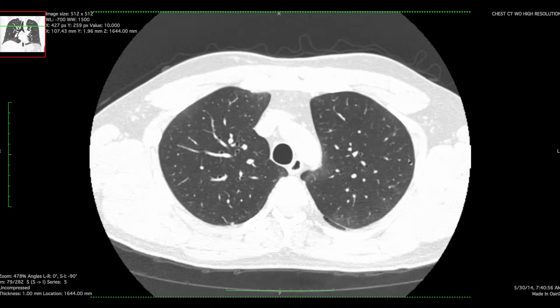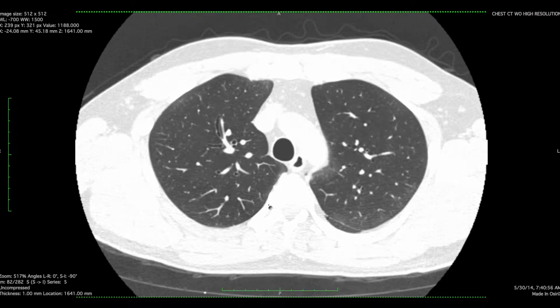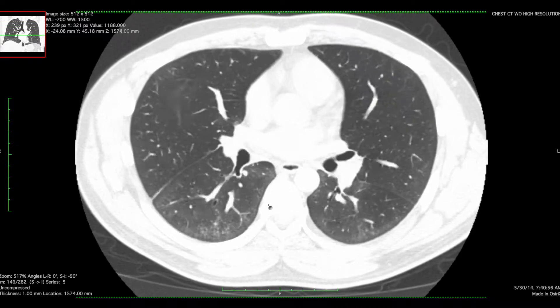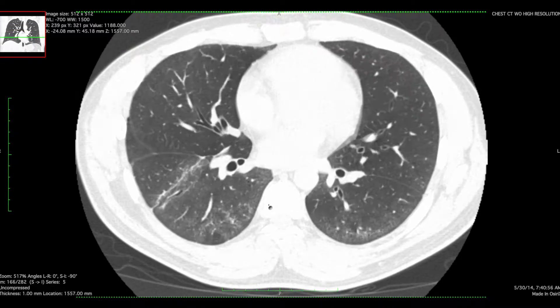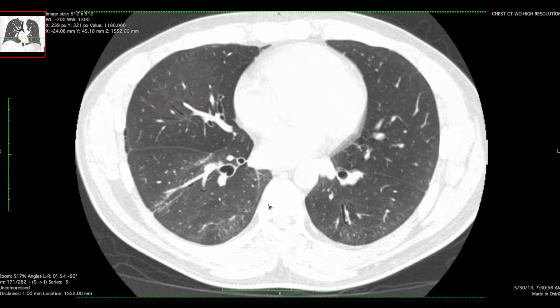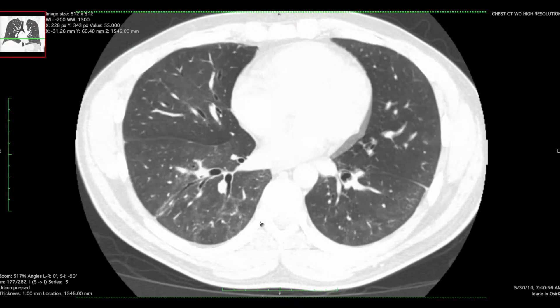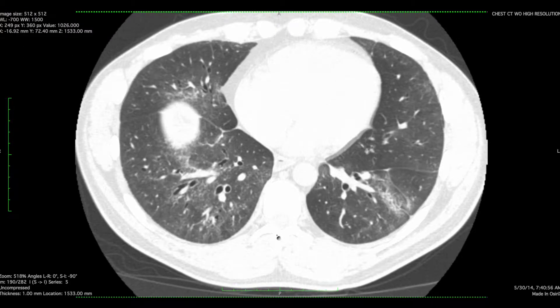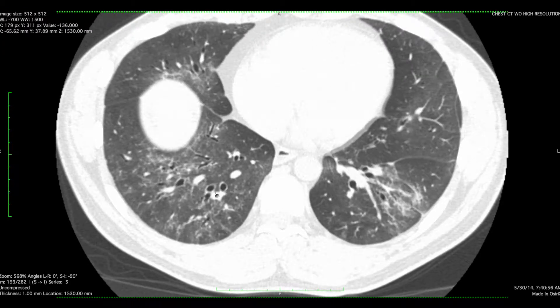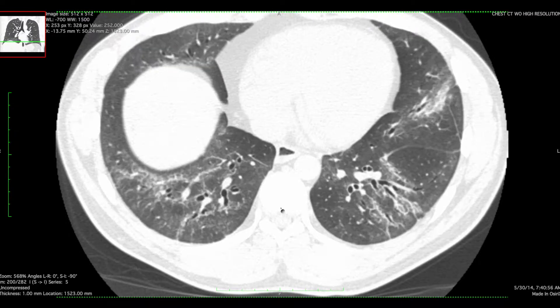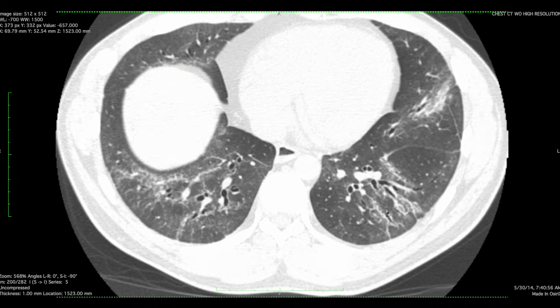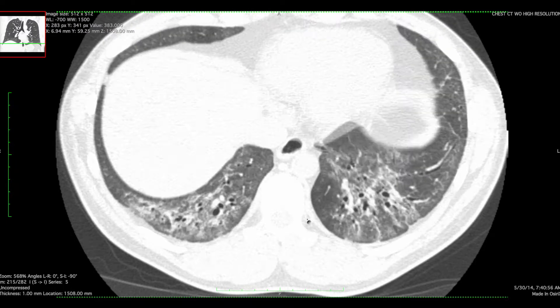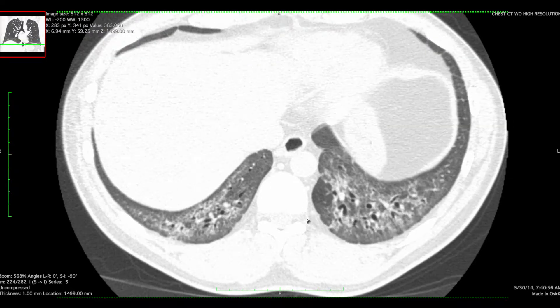Here's another ILD case. As we scroll through from top to bottom, it doesn't look like there's much going on in the upper aspect of the lungs. As we get into the mid lung zones, we start to see ground glass opacity with some mild superimposed reticulation and some associated traction bronchiectasis, which given that it's in association with this ground glass opacity and reticulation, we would feel pretty comfortable calling traction bronchiectasis.